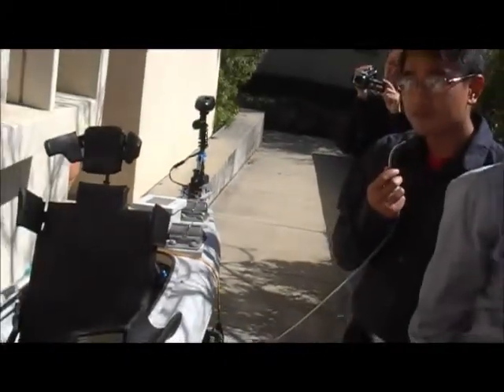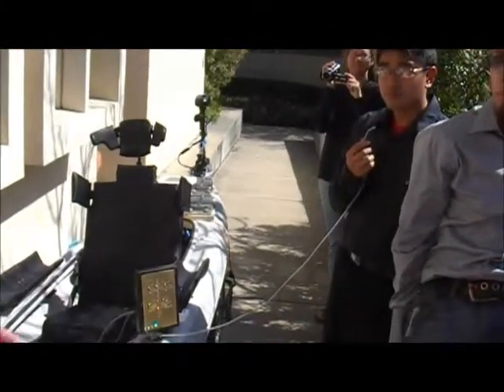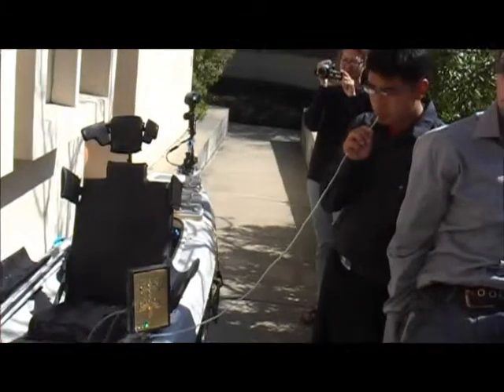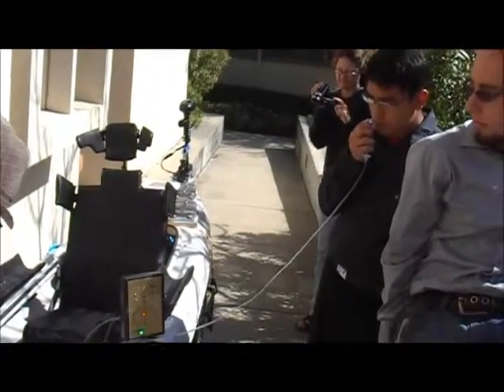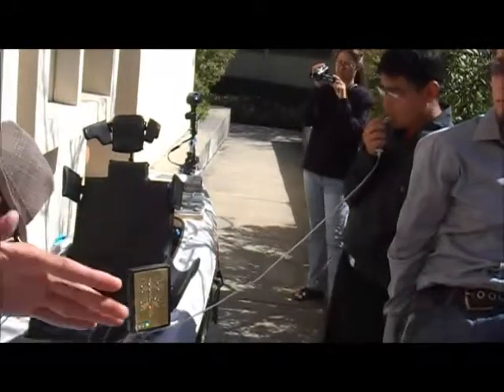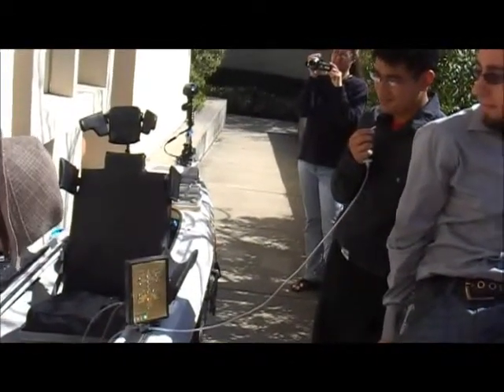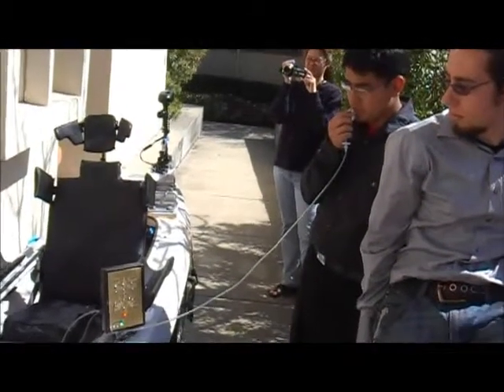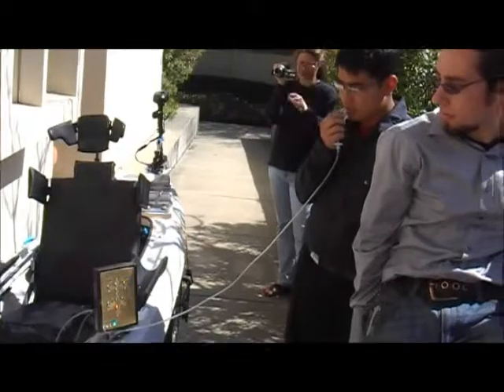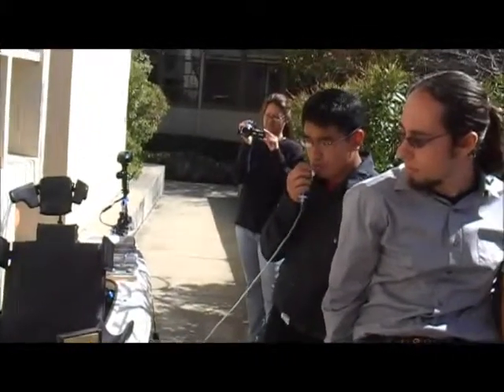Arun is going to demonstrate the sip puff controls. Short commands — short sips and puffs — correspond to speed forward and reverse. Long commands — long sip and long puff — correspond to direction commands which allow you to point left or right. As you can see, as Arun is putting in commands through the sip and puff controller, we're commanding our speed.